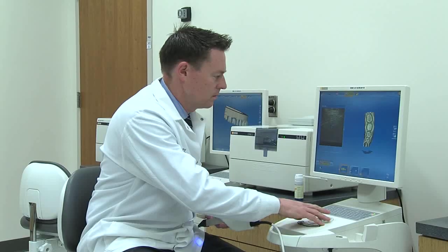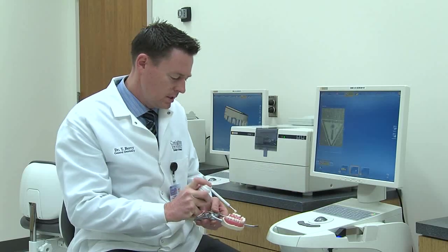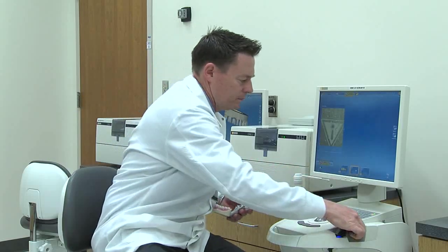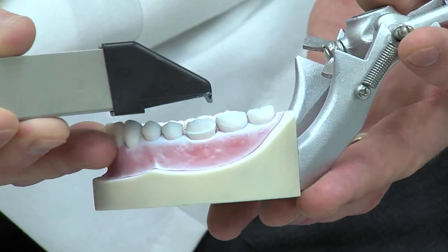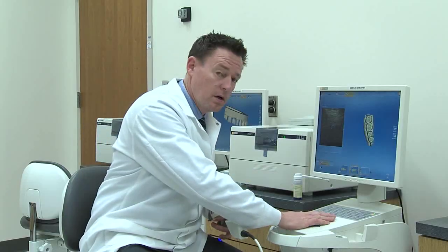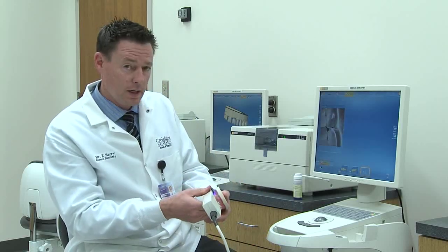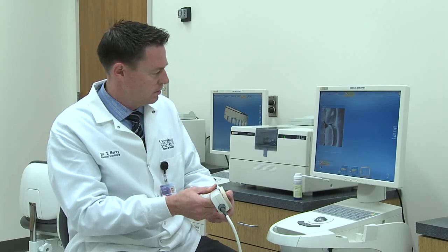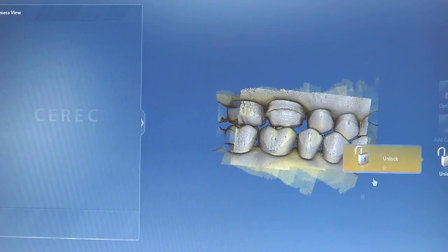Once we have the existing preparation and the adjacent teeth, we'll capture the opposing teeth. We'll powder it the same with our blue powder, and again capture the image with our camera. Now that we have the opposing arch, we need to capture what's called the buccal bite — that's the teeth together in relation to the upper and lower arch. And there we've acquired all the images necessary to create a single unit crown.